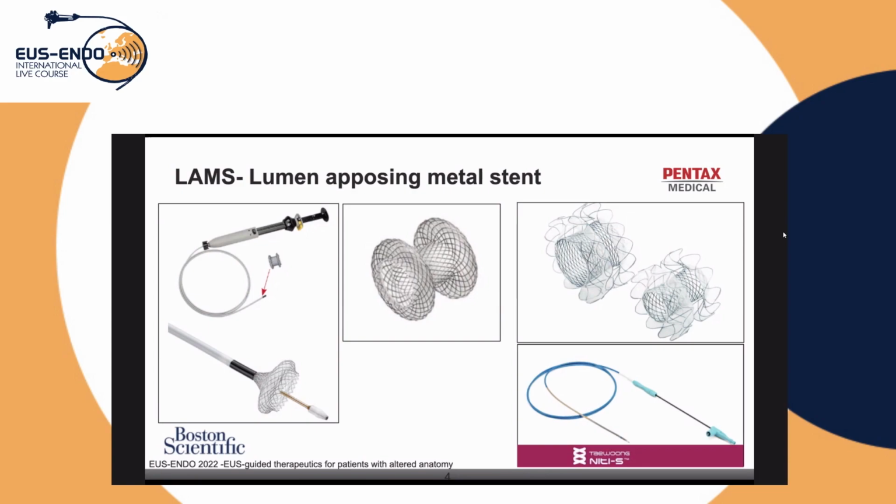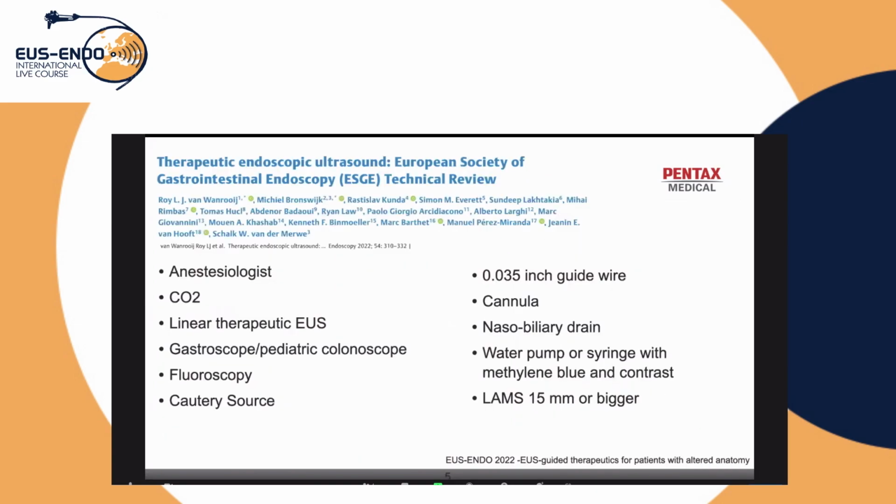This is a very short saddle-shaped stent with huge distal and proximal flanges that reduce the risk of migration of the stent during deployment, and it is silicone coated, which reduces the risk of leakage during the creation of the anastomosis. Moreover, the cautery tip, with a single maneuver, can introduce the tip of the stent into the target organ and release it at the same time.